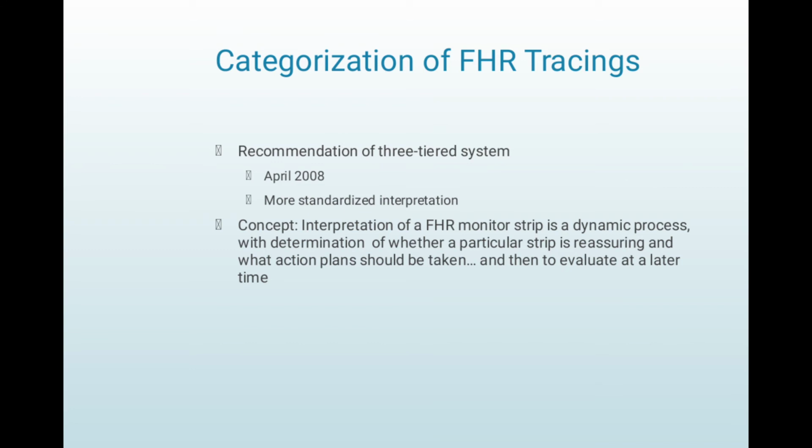Next is the categorization of fetal heart rate tracings. The recommendation is a three-tiered system, developed in April 2008 for more standardized interpretation of fetal heart rate monitor strips.